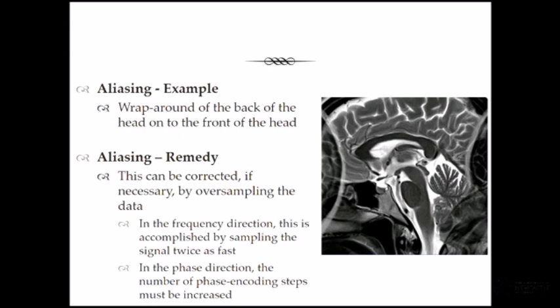And if you did, there's another function that you can turn on as the radiographer sitting at the console called no phase wrap, which just extends the frequency so that they don't get miswrapped. So it's a really useful tool for limiting this. It can be corrected. A couple of ways that you can correct this artefact would be to use a larger scan field of view, or to use your no phase wrap, which artificially extends the scan field of view, even though you don't look at those images.